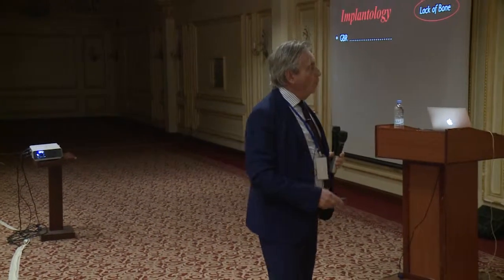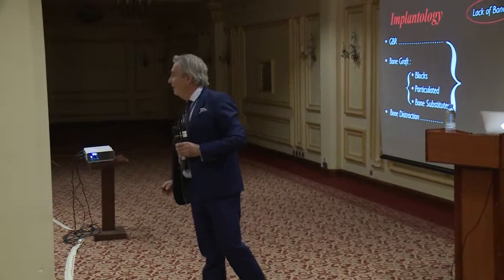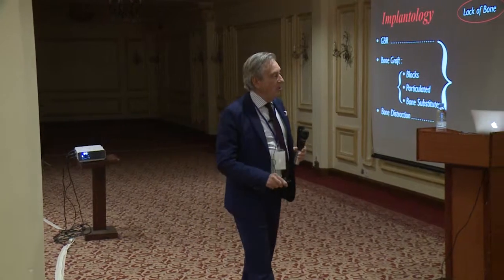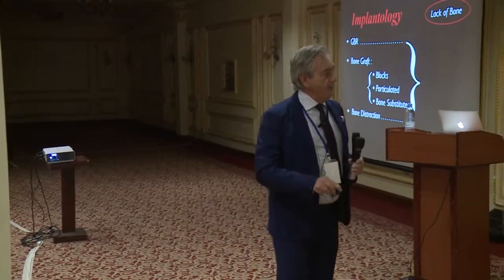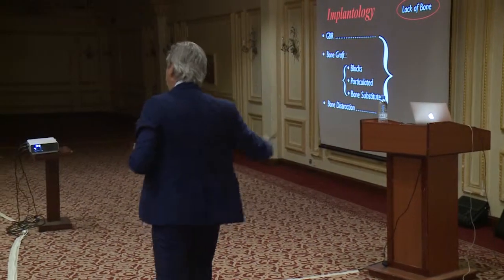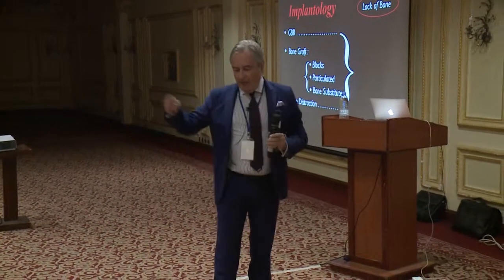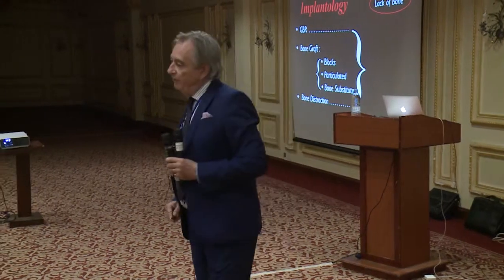When we have a lack of bone, we have GBR or GTR procedures. We have the bone grafts, represented by bone block grafts, particulated, bone substitutes, beta TCP, or xenograft, allograft, etc.